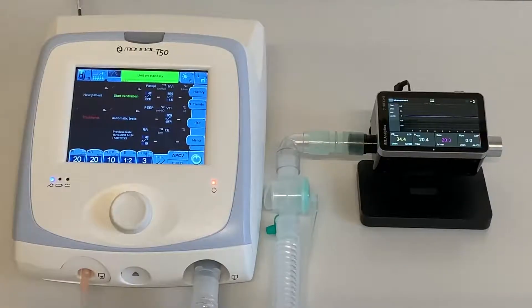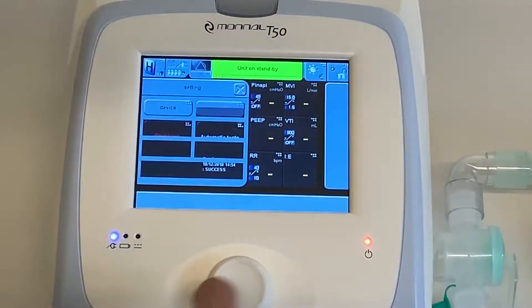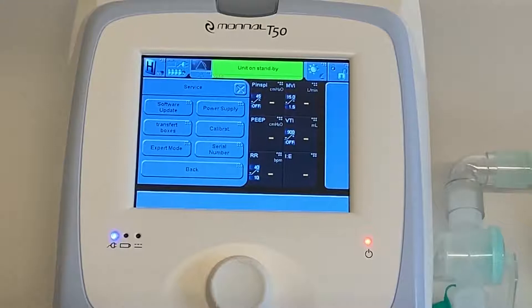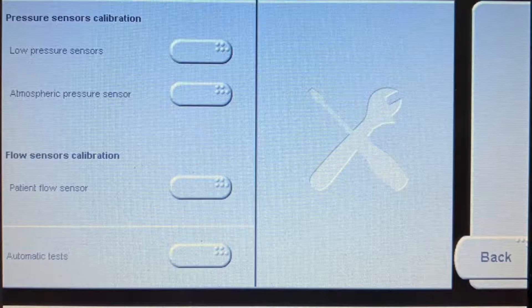The first measurement we do is flow sensor calibration. Press and hold the control knob and press the automatic test button on the screen. Select Service, then select Calibration. Select patient flow sensor under flow sensors calibration.